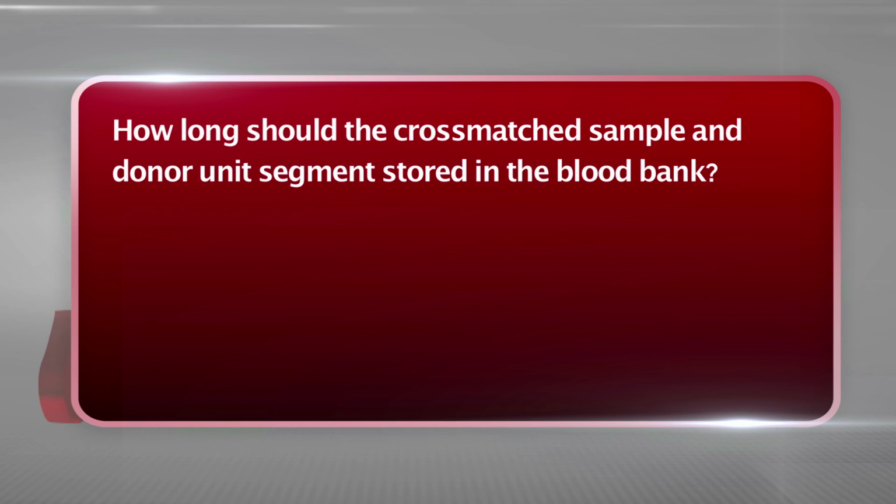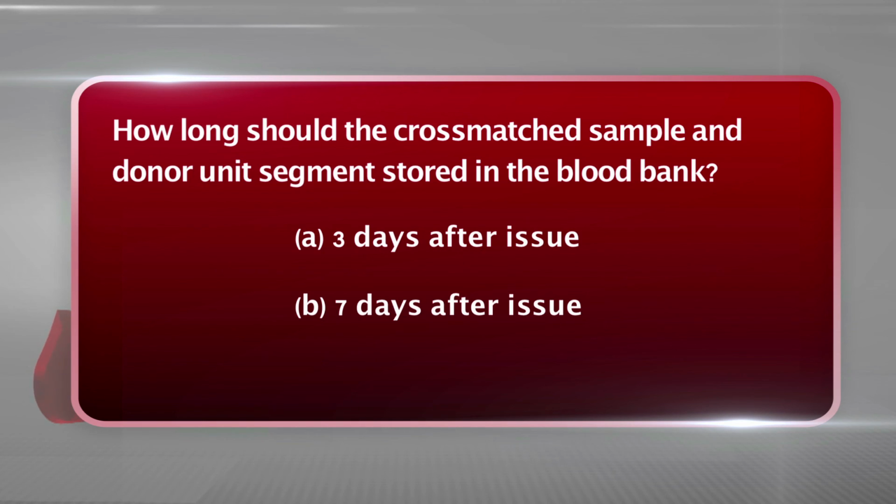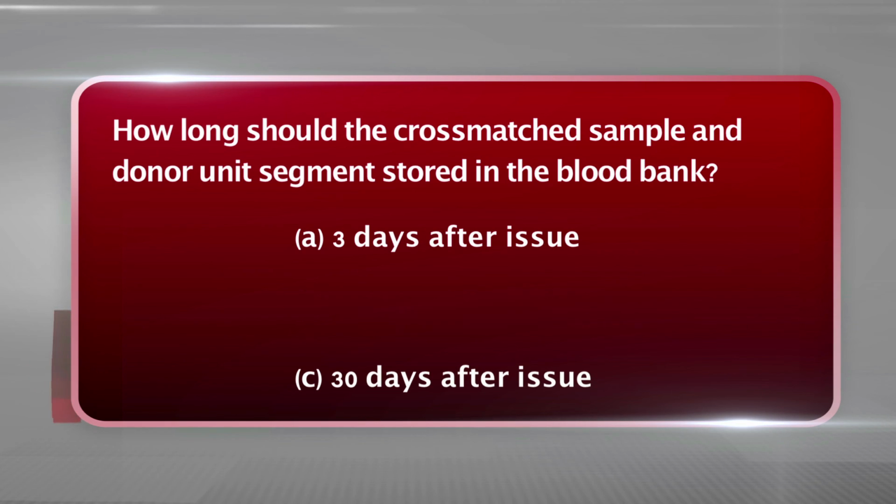How long should the cross-matched sample and donor unit segment be stored in the blood bank? 3 days after issue, 7 days after issue, 30 days after issue. The correct answer is B.